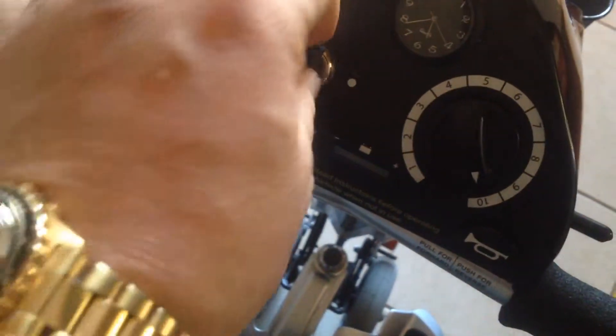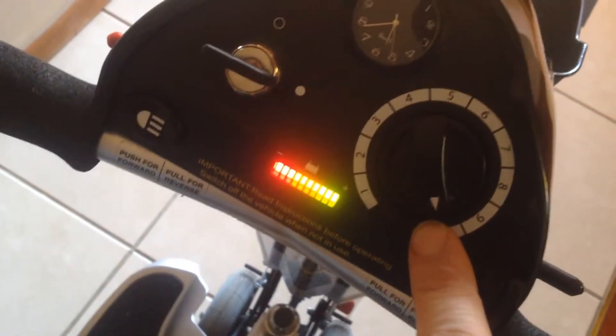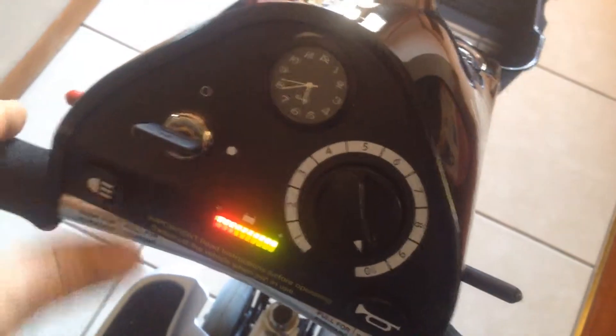It's also got armrests which you can move to not only adjust how you support yourself, but to get in and out of the unit — a handy thing to have. Controls are dead simple: you just turn the key off and on. The battery is already all charged up and ready to go. This dial sets your intensity — how fast you want it to go when you pull the paddles. You push the paddle forward to go forward and backwards to go backwards. And of course, a horn and a headlight, which I can't show you here because it's daylight, but it works.